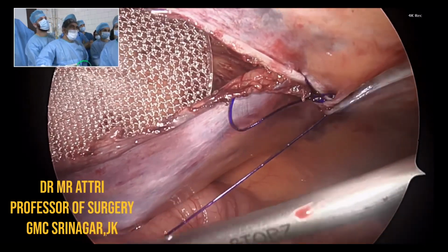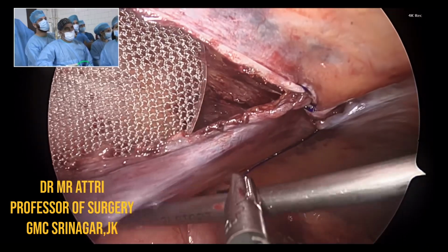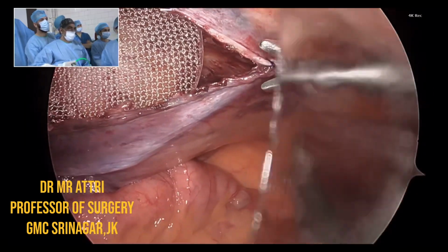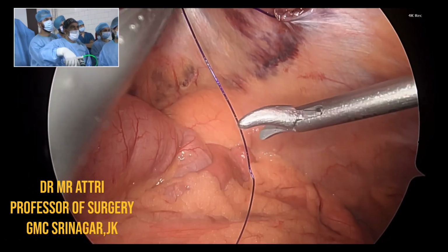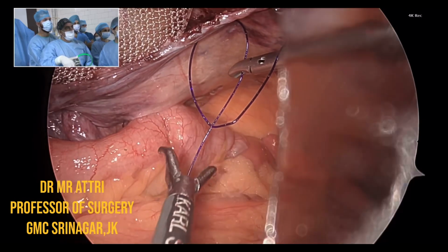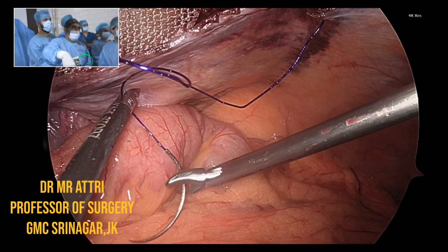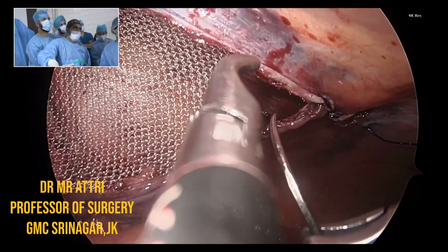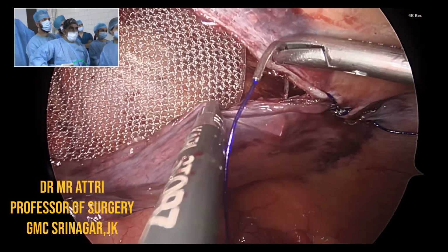Sir, we know in private practice and in government practice, there is a lot of difference. You can make the patient understand that it is going to resolve very soon. But in practice, sometimes a patient comes from outside India, and he says, I need to resolve it right now. So under aseptic precautions, you aspirate that, or you want to prevent that. If it is a large one, you can give pressure over the hernia place with two or three pads.